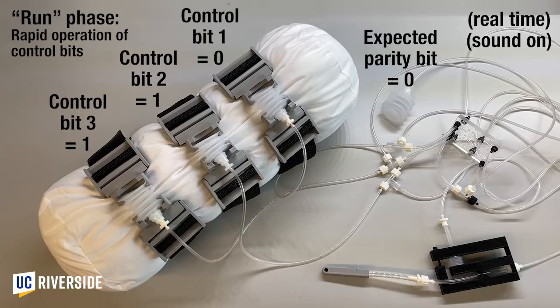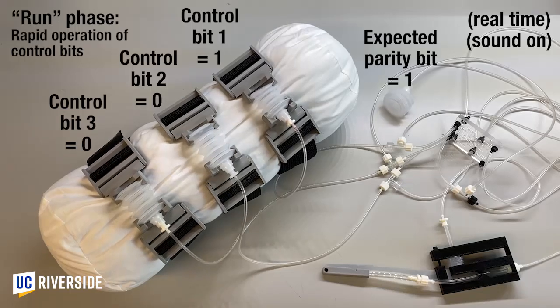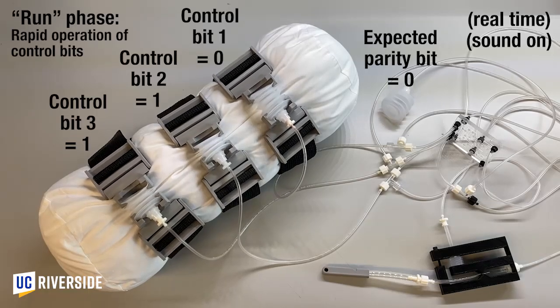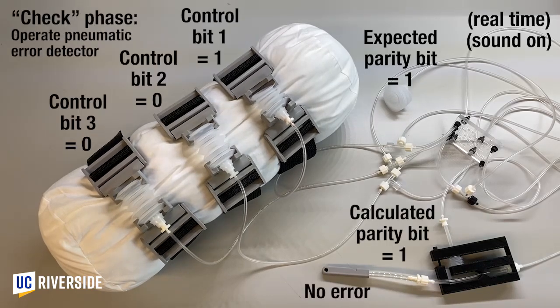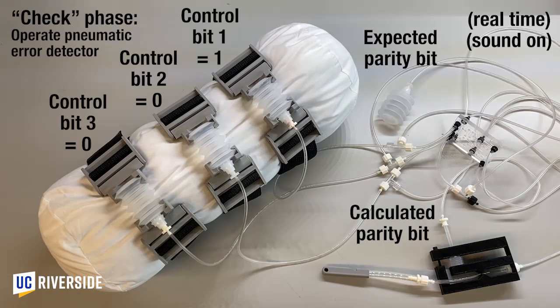This video demonstrates a different mode of operation. In this mode, the system alternates between two phases. In the run phase, the pneumatic error detector is not operated, so the control bits can be actuated rapidly, as shown here. After a while, the system enters the check phase, shown here. The controller applies vacuum to each of the control bits one at a time, and the pneumatic error detector compares the expected and calculated parity bits after each step.